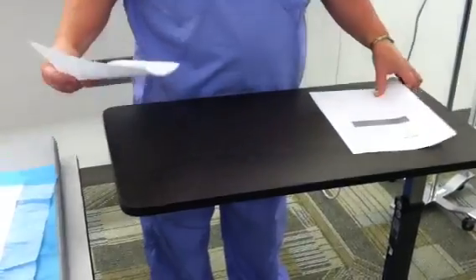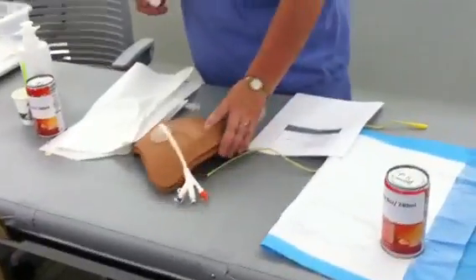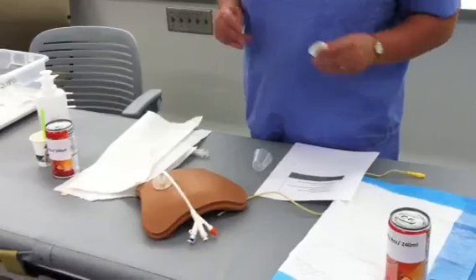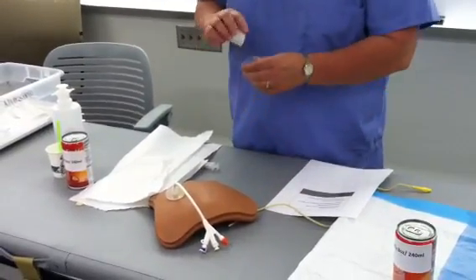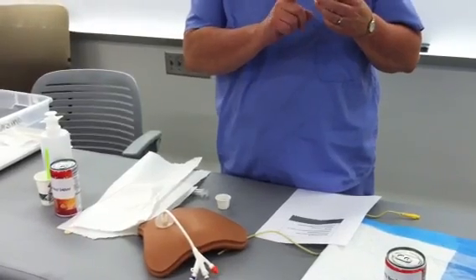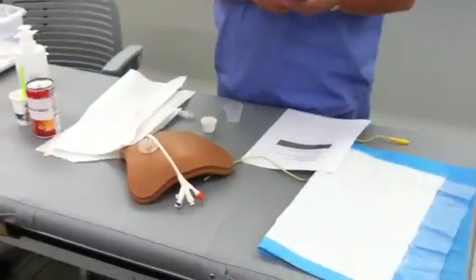Okay, so we've done our first check, we've checked our MAR against the physician orders, then I'm ready to get my medicines ready. So this patient's on XYZ medicine and ABC medicine. I made sure that they can be crushed, so I'm going to crush those medicines. I'm going to put them in a plastic cup. I'm going to label the cup with a Sharpie. I'm going to put the drug and the dosage, but I'm going to wait to mix the water till I get in the room. And I also need my can of formula.